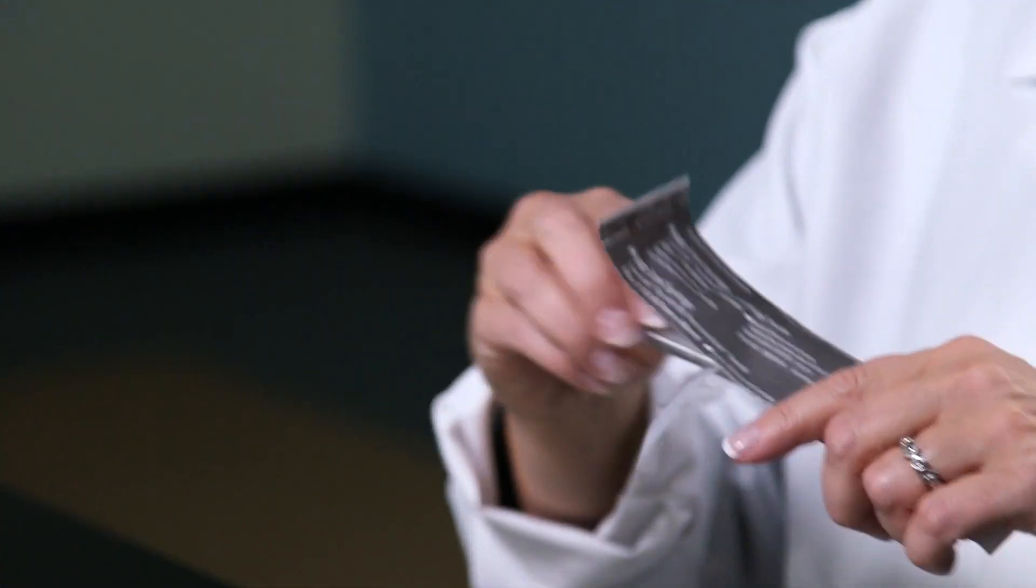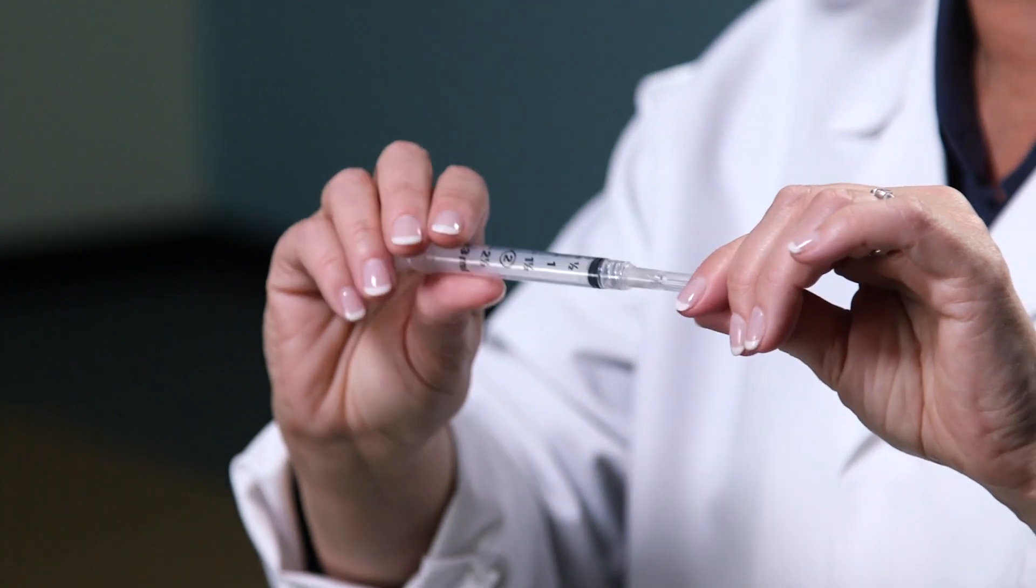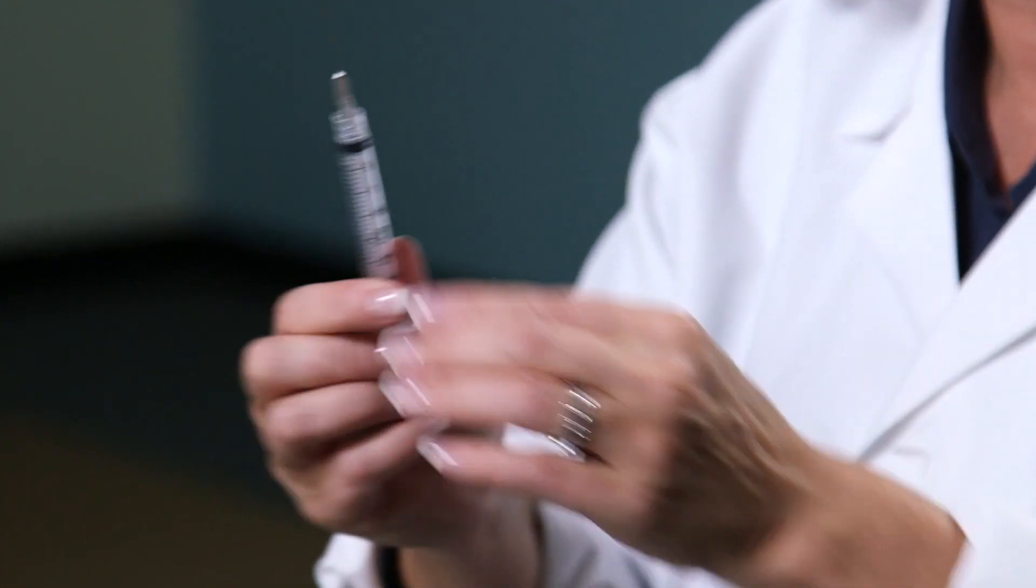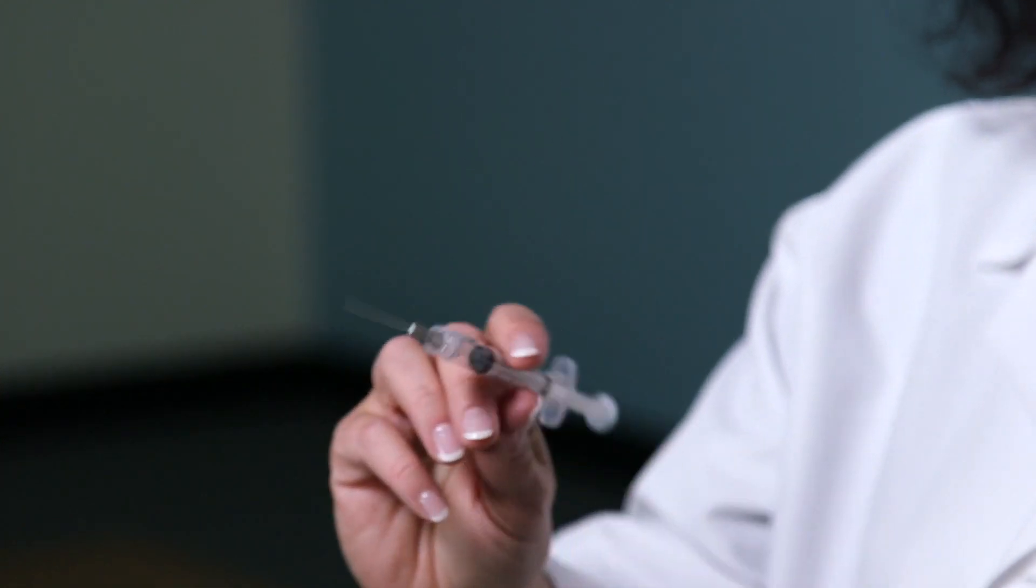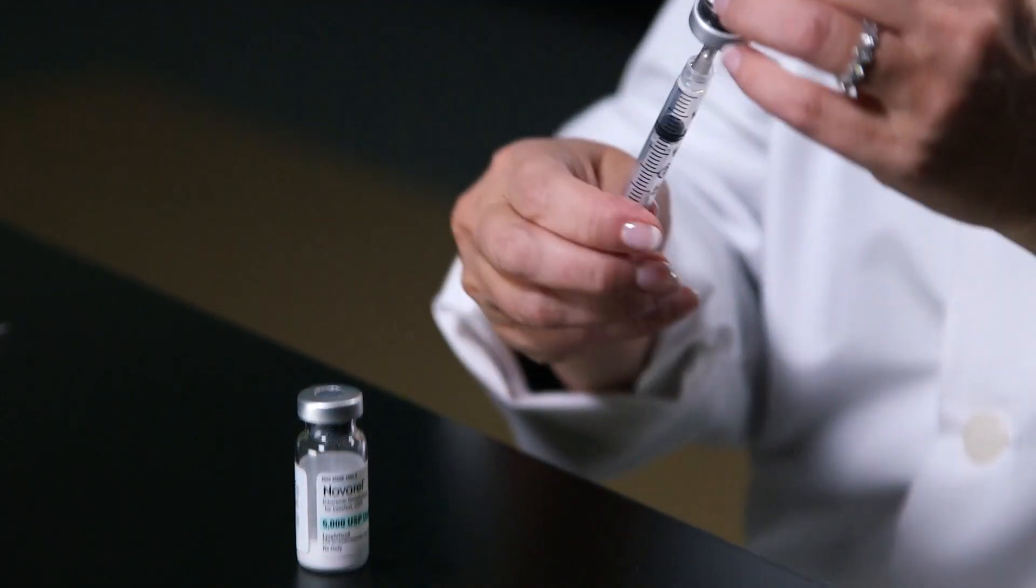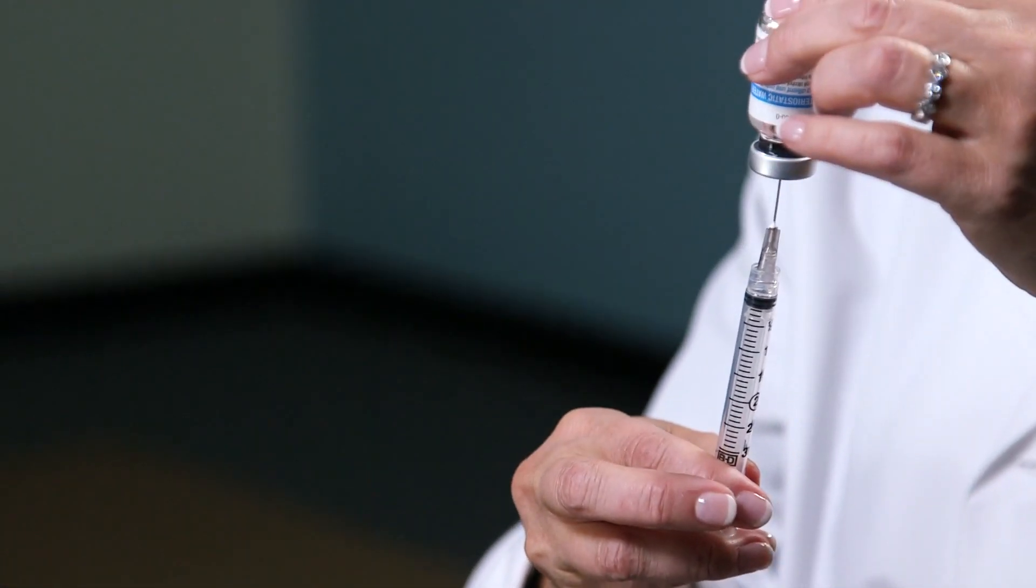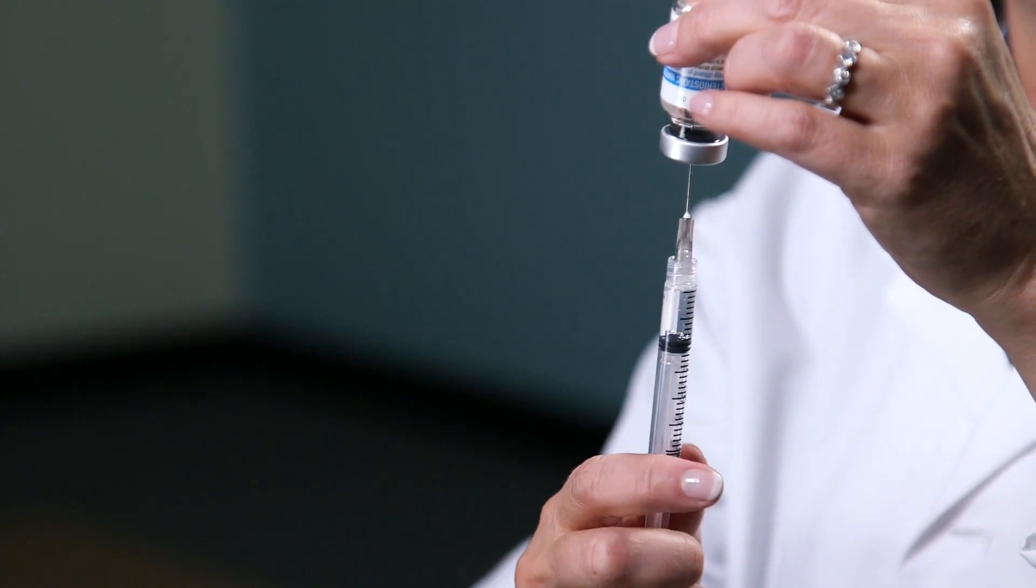Using a 3ml syringe with generally a 22 gauge, 1 1⁄2 inch needle, pull back the plunger to the prescribed amount, usually 1ml. Place the needle through the center of the rubber stopper. Inject the air. And then pull back the plunger to the 1ml mark, or the prescribed amount.